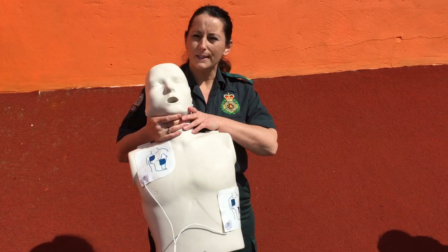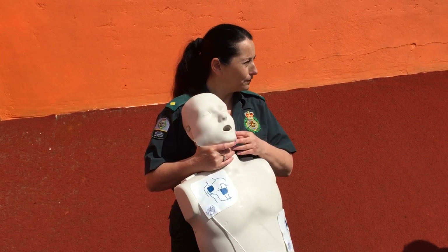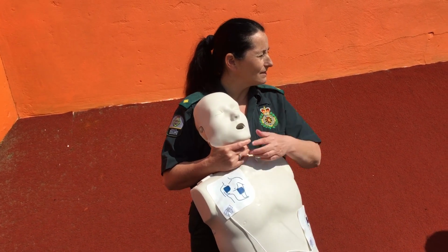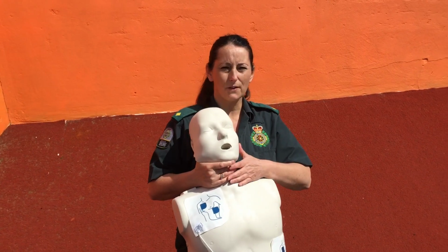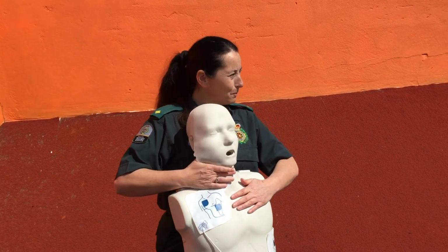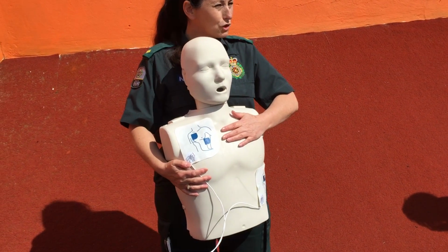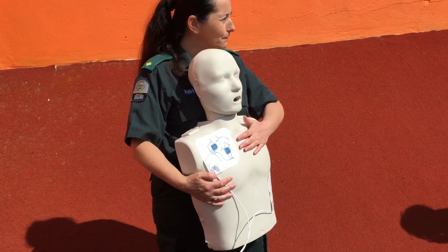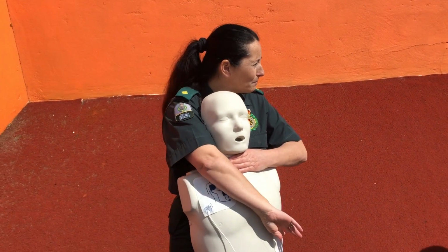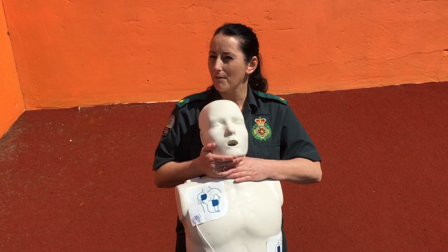I'll ask you a question. If you cut someone's clothes off and they had a pacemaker over this side, or they had a couple of piercings over here, what do you think you could do with the pads? So you put it the other way around. Yeah, so you can put one there, you can put one there. The shock isn't going to be quite as effective through the heart, because it needs to go from this pad through the heart back through to this pad. But what you have to remember is something's going to be better than nothing.